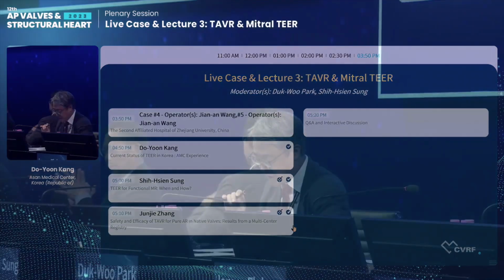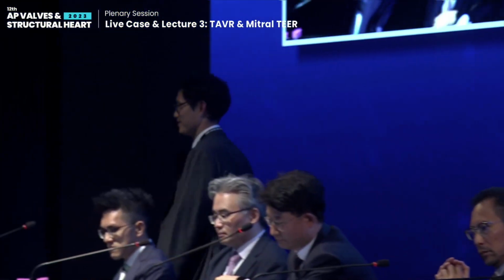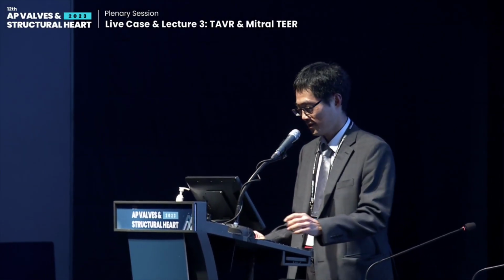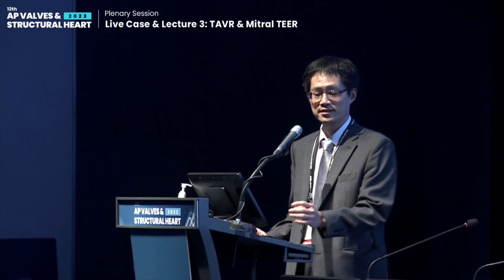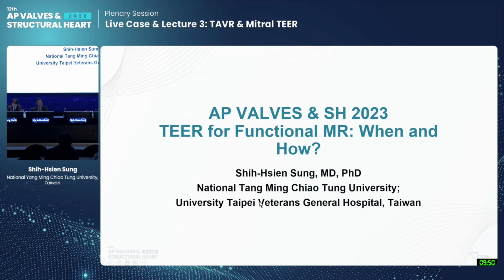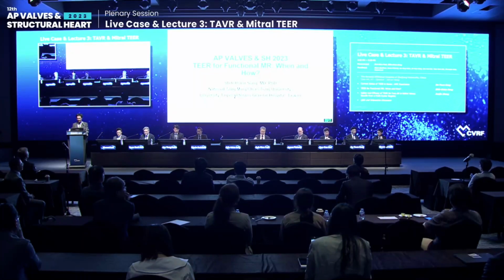Okay, thank you, Professor Kang. And the next speaker is Professor Shih-Hsien, on TEER for functional MR, when and how. Professor. Thank you for the introduction. Following Dr. Kang, who has presented the advantage of TEER in functional MR at Asan Medical Center, I would like to present TEER for functional MR, when and how.